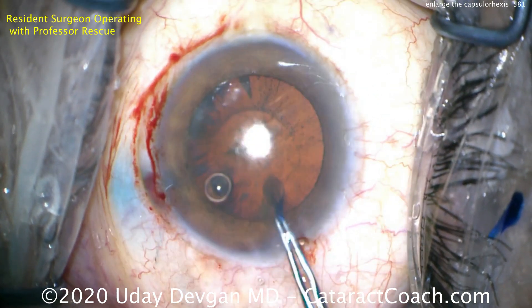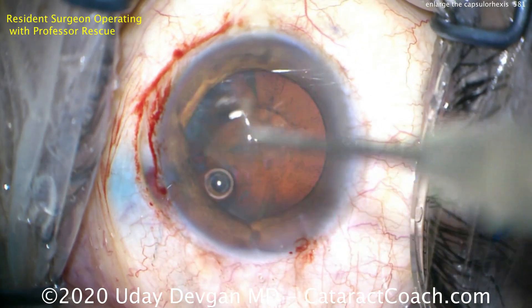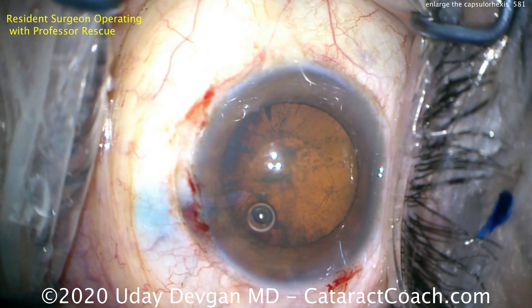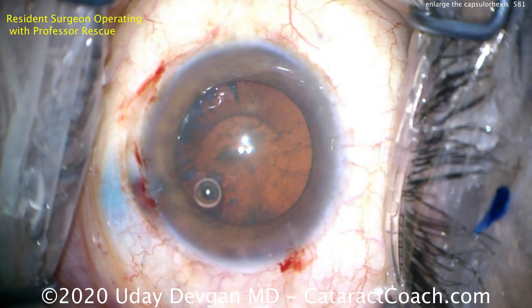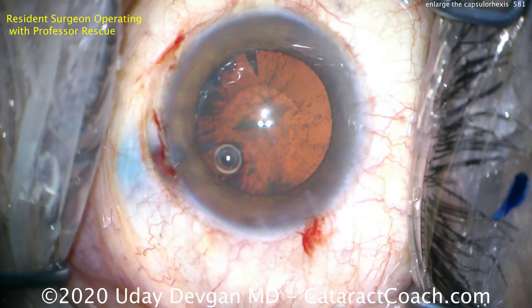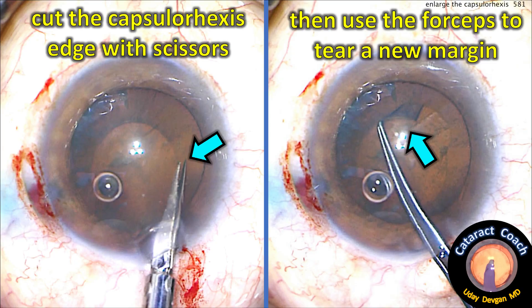That is a complete capsulorrhexis by the resident, but it's just not going to cut it. Let's irrigate the eye and evaluate — you can see that small capsular opening. We need to do better, so we're going to enlarge this existing capsulorrhexis very carefully by first nicking the capsule with scissors.